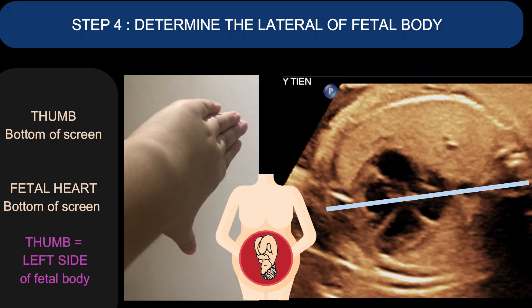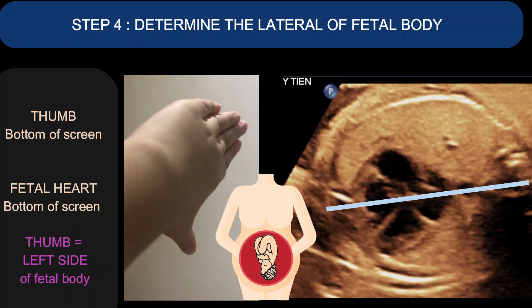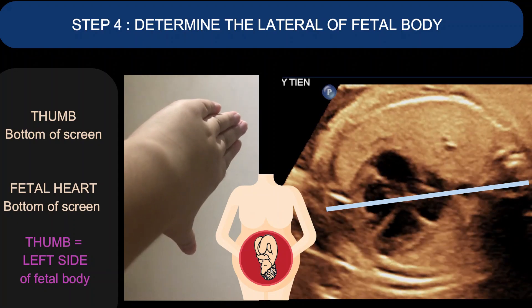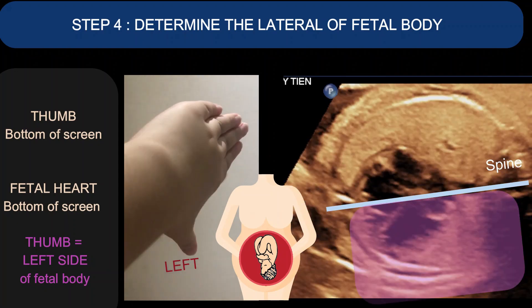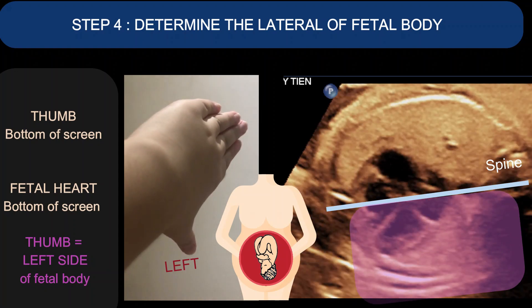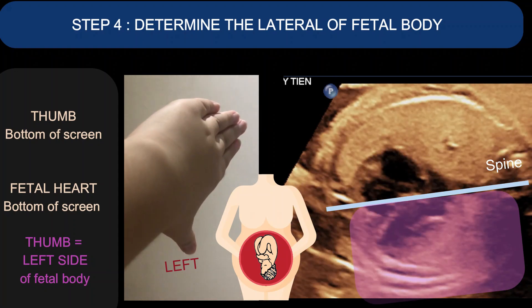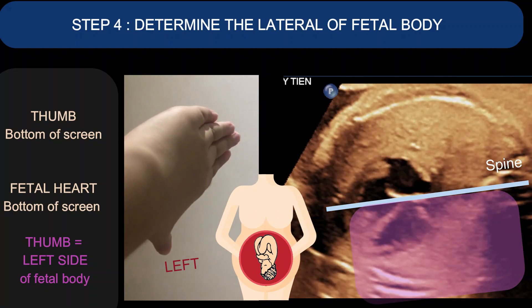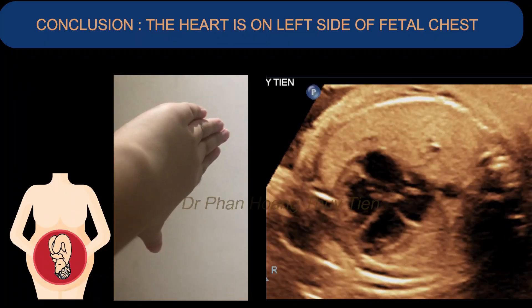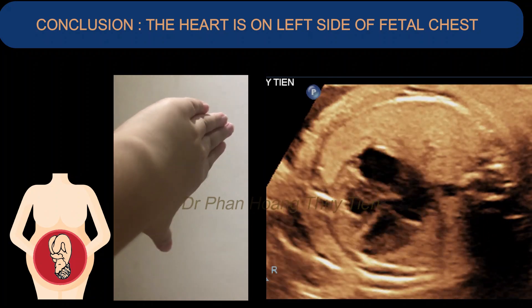Step 4 — determine the laterality of the fetal body: with the transverse view, create a straight line from the spine that divides the fetal body in half, then apply the technique. You will see that the thumb is at the bottom of the screen; the fetal heart is also at the bottom of the screen. The thumb points to the fetal left side, which leads us to the conclusion that the heart is on the left side of the fetal chest.